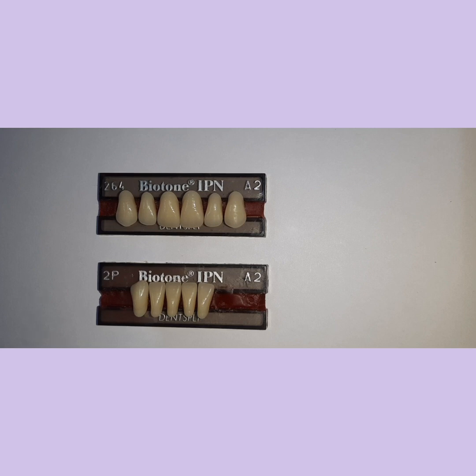So, complete dentures are aesthetically pleasing when the teeth are in harmony with the facial musculature, facial profile, facial form, matching the color of the eyes, skin. So all these we need to keep in mind when we are selecting teeth in the anteriors. Whenever we want to do selection of teeth for the anteriors, always talk to the patient, take a proper history, ask for any pre-extraction records.